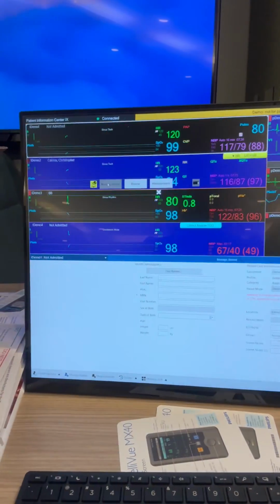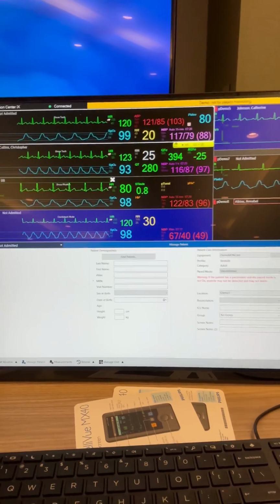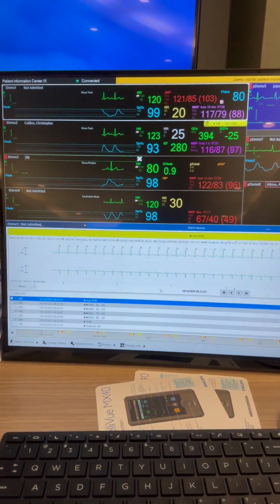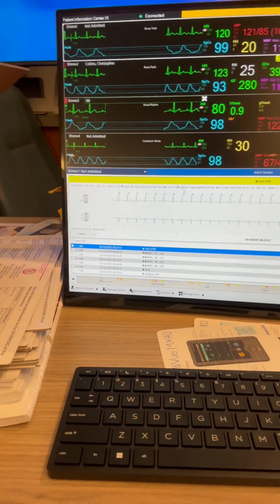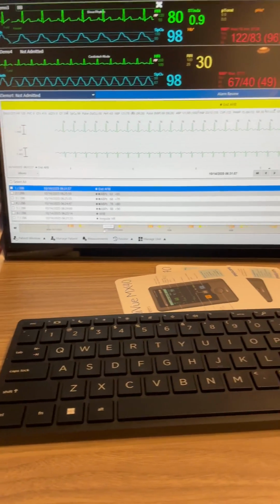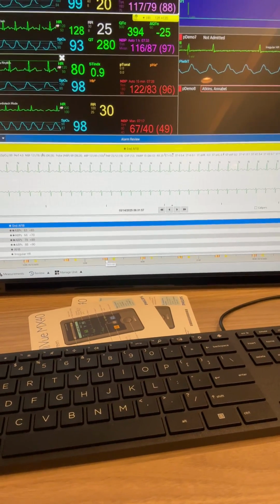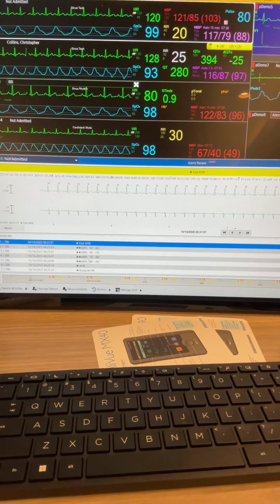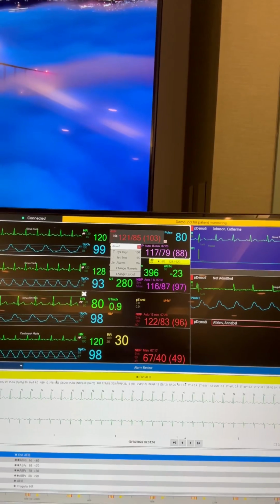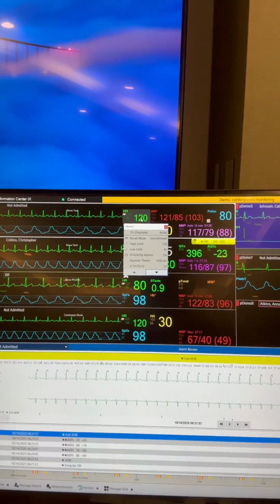In these, you can manage your patient, let me go back, by admission or updating. You can review all your alarms. These are your alarms. They'll show up yellow if they're not urgent. These little things down here, the red is urgent, the yellow is just AFib, whatever you've got it set as. If you want to make a change for your alarms, you just click on the alarm. If you want to check on the alarms on the rate, for the heart rate, you just click on that.